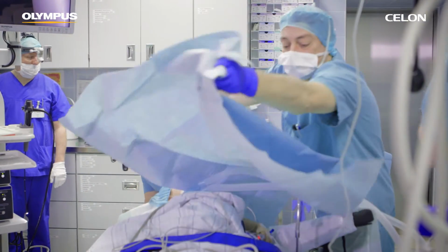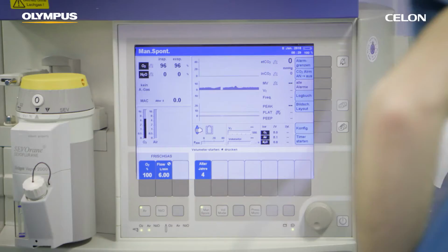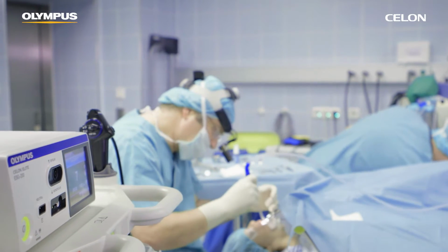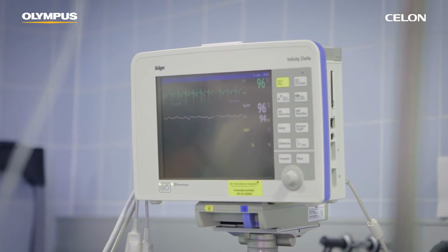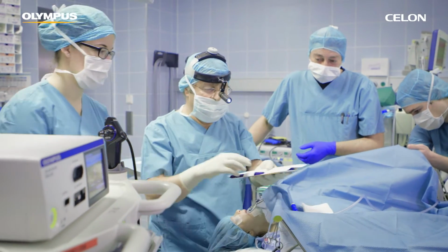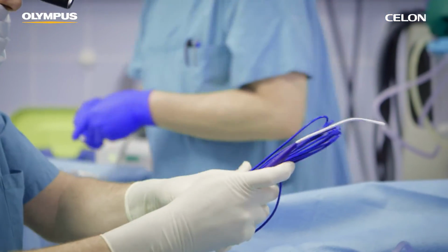This video demonstrates how to use the CELON method in children to reduce the volume of hypertrophic tonsils by about 30 to 40%. The use of intubation anesthesia is recommended. In older children, you can also use a laryngeal mask to administer anesthesia. Perioperative antibiotic prophylaxis, for example cephalosporin, is rarely necessary.